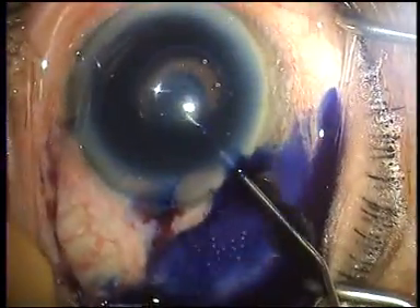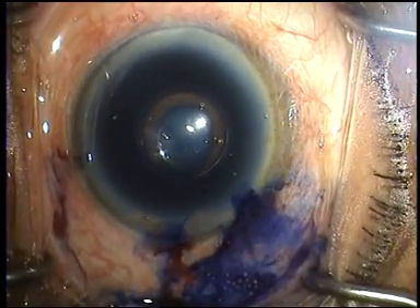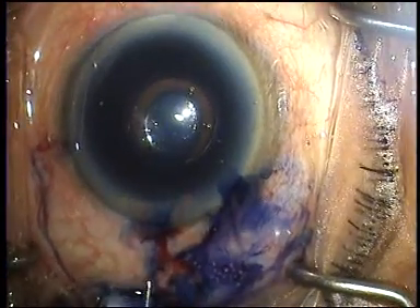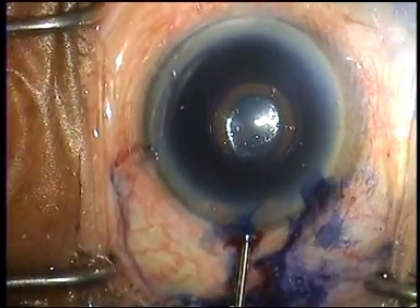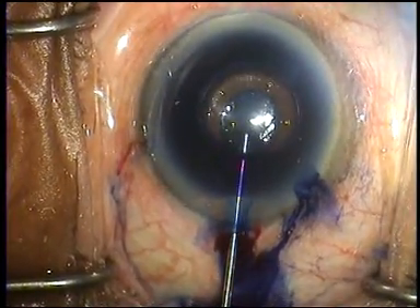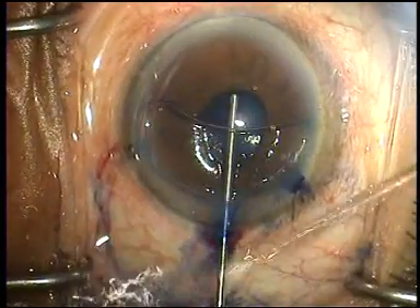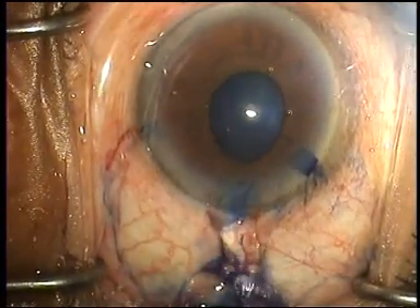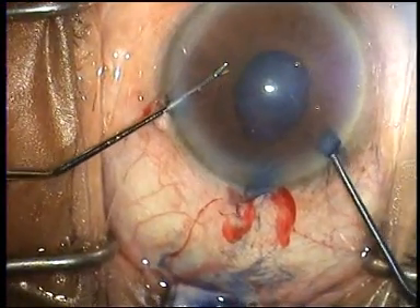Once vision blue has been injected into the eye, we express it from the eye with a gradual flow of viscoelastic from the area diagonally opposite that of the incision. In this way, all the vision blue exits from the eye cleanly together with the air bubble. At this point, two Y-hooks are brought into the anterior chamber.